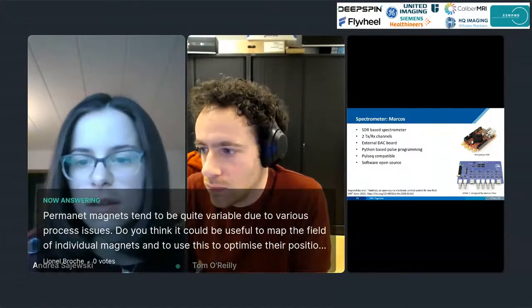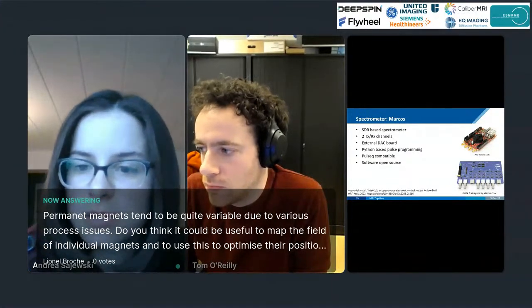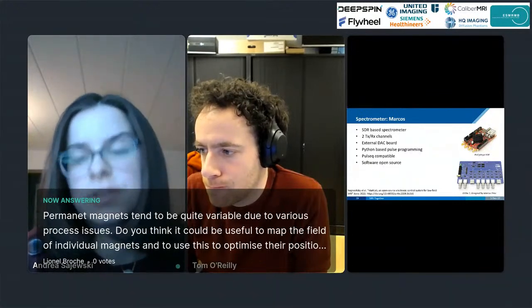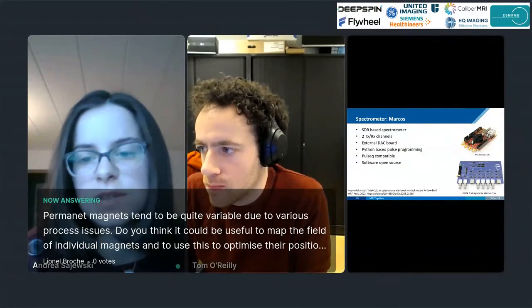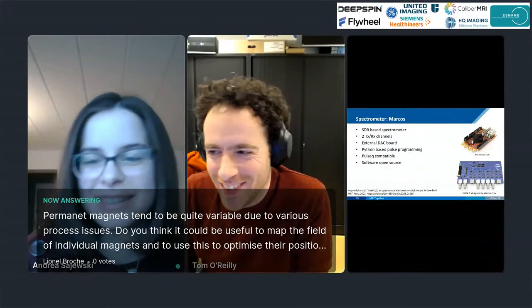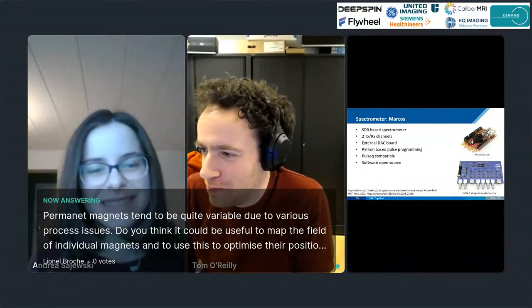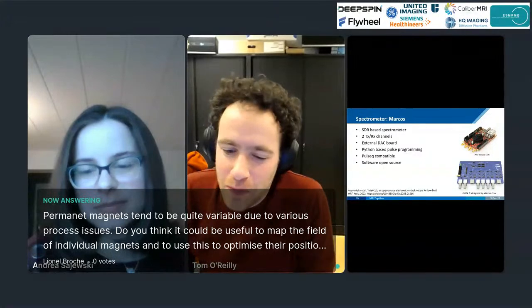Okay, another question from Lionel here. Let's see if I can read the whole thing. Permanent magnets tend to be quite variable due to various process issues. Do you think it could be useful to map the field of individual magnets and use this to optimize their position in the Halbach magnet? It would be time consuming though. Yes. It would be very time consuming. If Lionel comes to Leiden and measures the next batch for me, then yes, I will very much consider that.